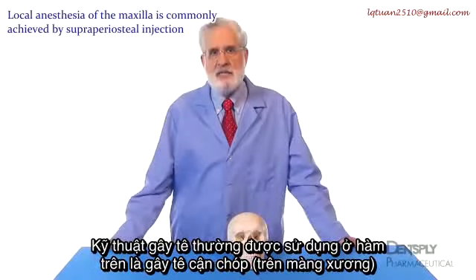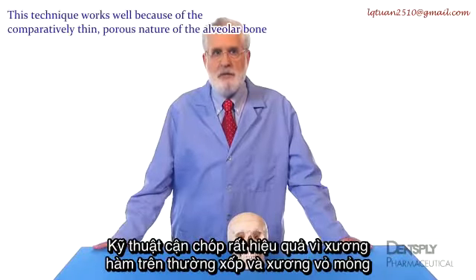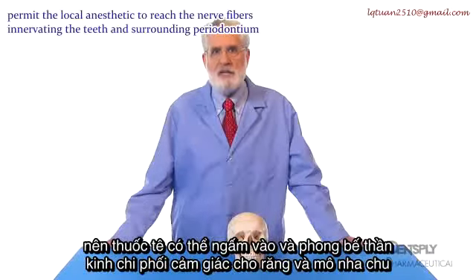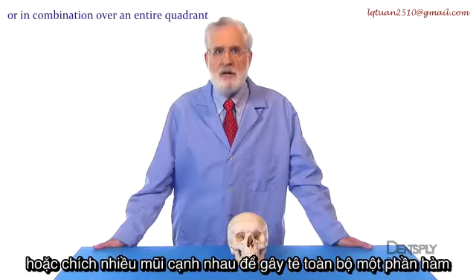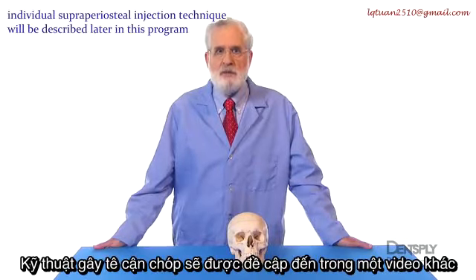Local anesthesia of the maxilla is commonly achieved by supraperiosteal injection. This technique works well because the comparatively thin and porous nature of the alveolar bone permits the local anesthetic to reach the nerve fibers innervating the teeth and surrounding periodontium. Supraperiosteal injections can be used singly to anesthetize individual teeth or in combination over an entire quadrant. Individual supraperiosteal injection techniques will be described later in this program.